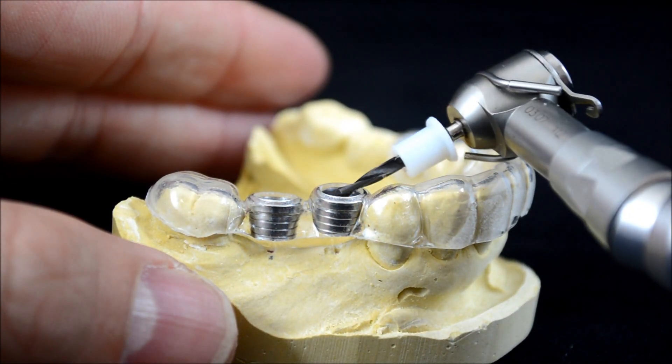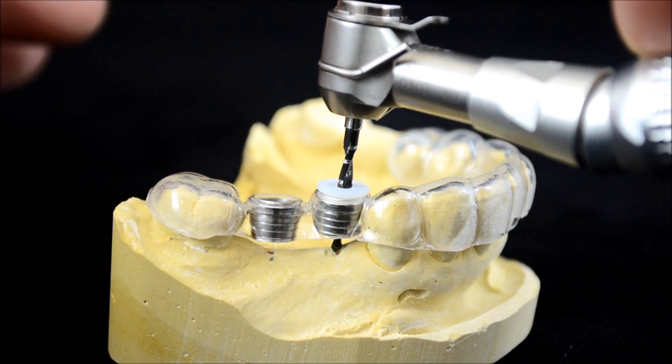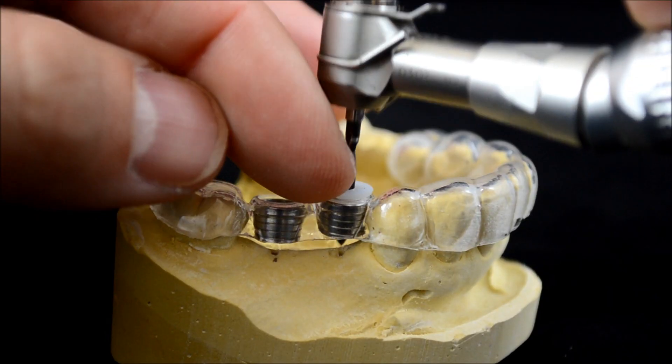If vertical space permits, replace the tube guide and drill to depth along the planned trajectory with the disposable drill stops we provide for each drill in the sequence.